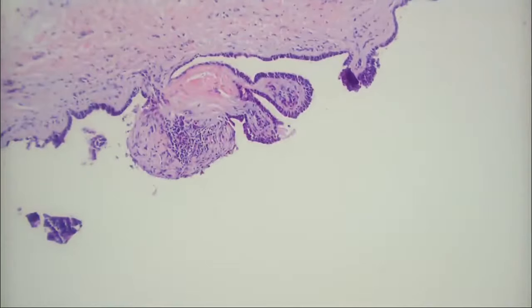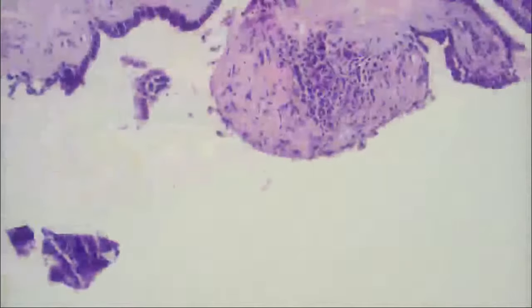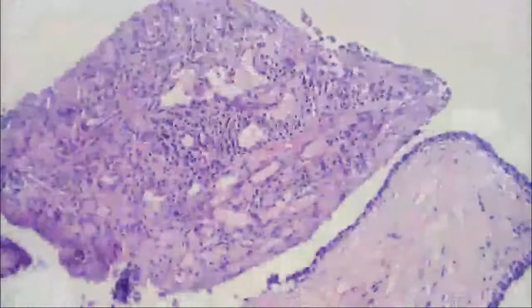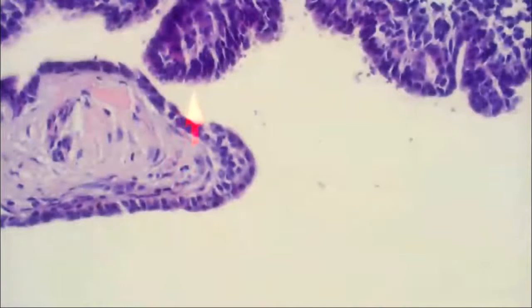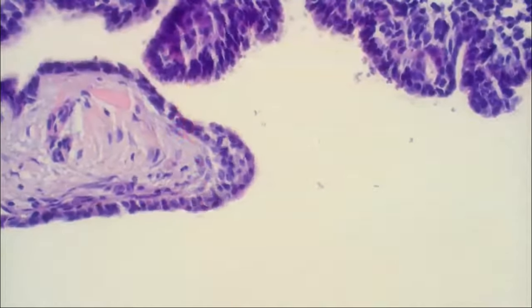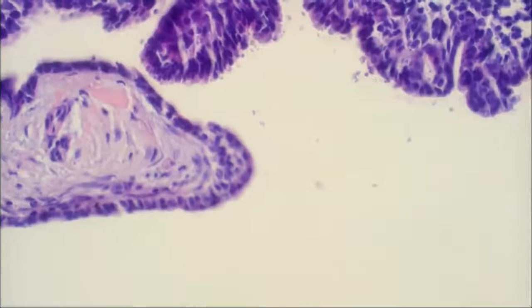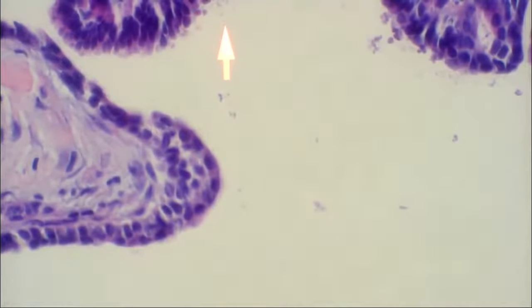I thought it might have been some sort of stratified columnar or cuboidal. There was some of that, but if you look carefully in some of the other areas, there were some little things like we see right here. At high magnification, what are these little blebs that are kind of coming off the top like a lava lamp here? Are those cilia? Cilia don't look like little lava lamp blebs. They look like little tiny hairs. So here we've got lava lamp stuff that's being pinched off and floating out into the surface.